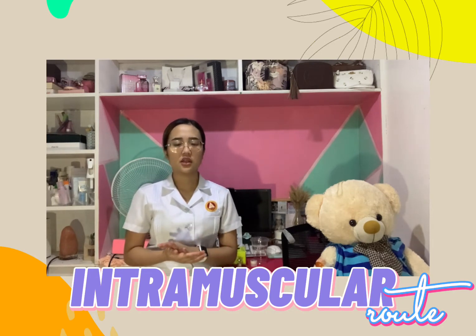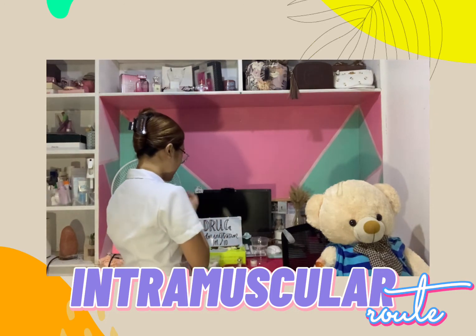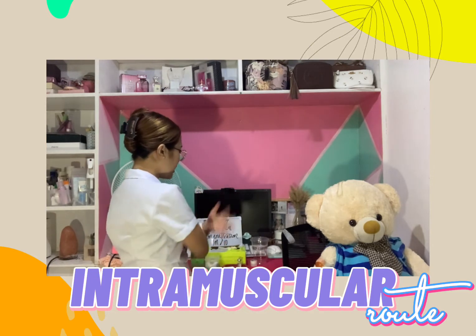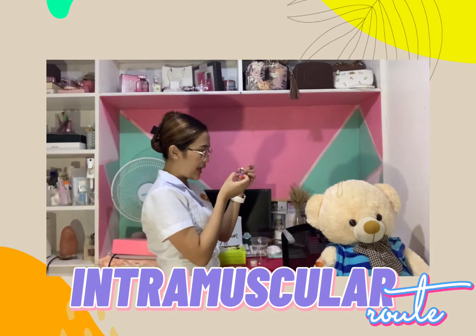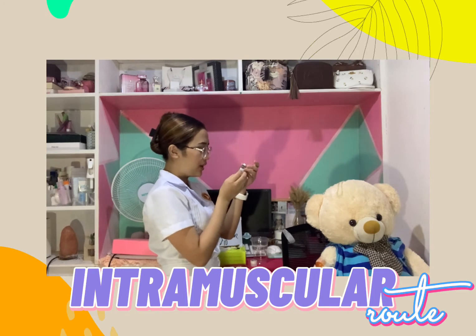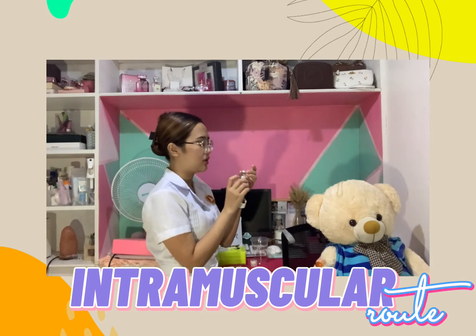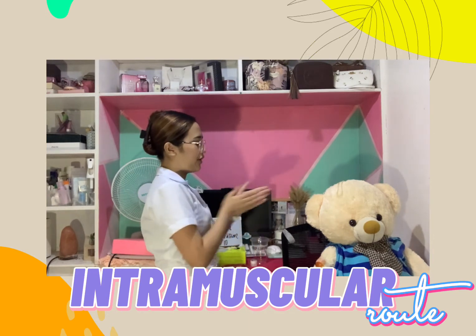So we can now proceed to the implementation. We will perform hand hygiene or any infection control technique prior to the procedure, and we will start the preparation of the medicine. First, we will read the label: Vaxigrip influenza vaccine. We will assess if there are cracks. There are no cracks, there are no foreign bodies, and the clarity of the vaccine inside is in good condition. We can start the preparation of the vial.